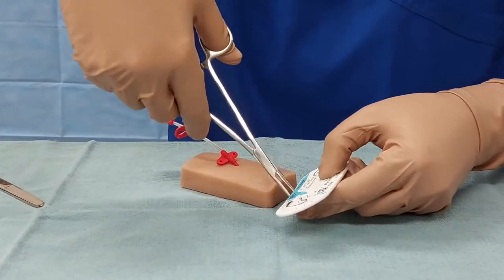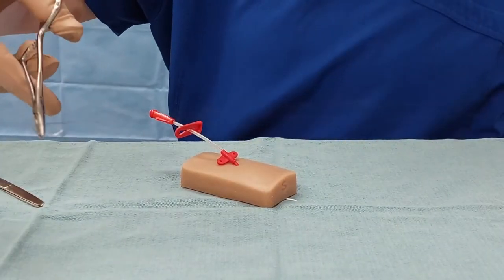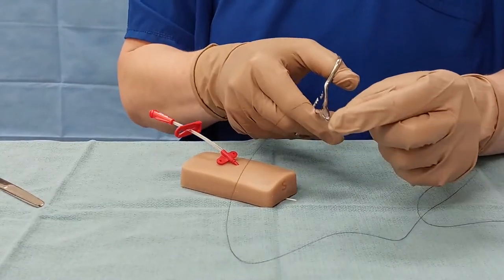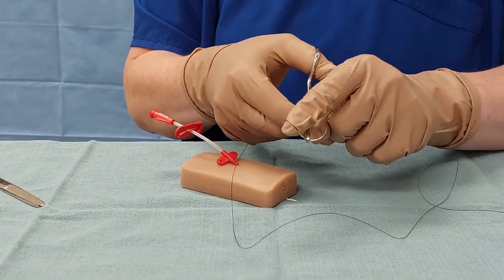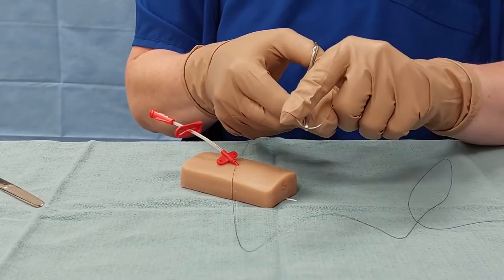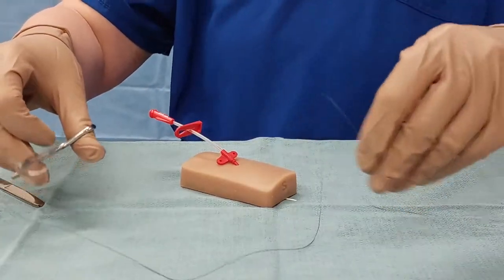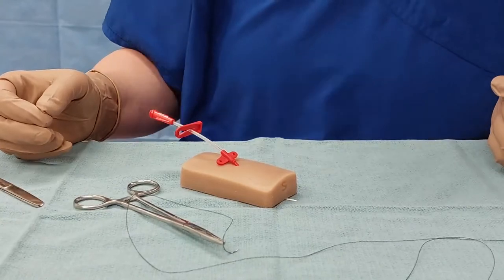I'm going to pull out my needle here. I want to load my needle somewhere between half and two-thirds of the way along the needle towards where the thread comes out at the end. Before I put my line in, I usually have that loaded and ready to go on my sterile field.